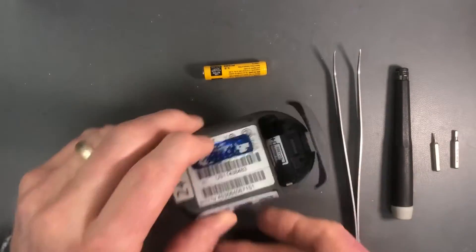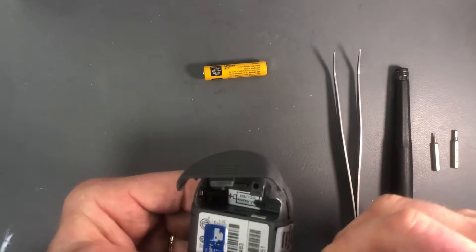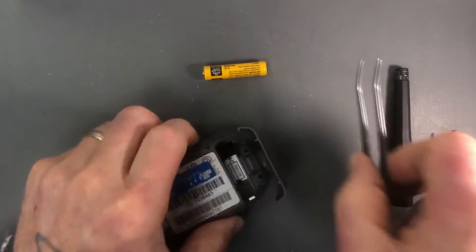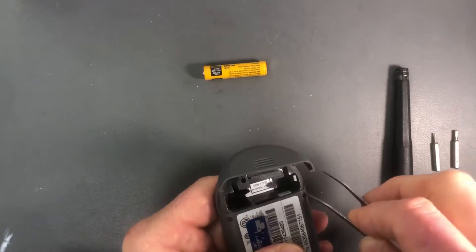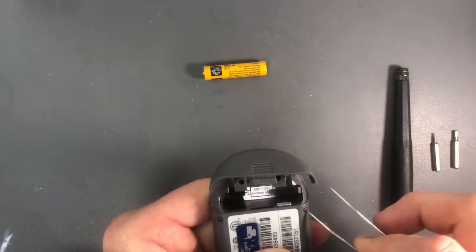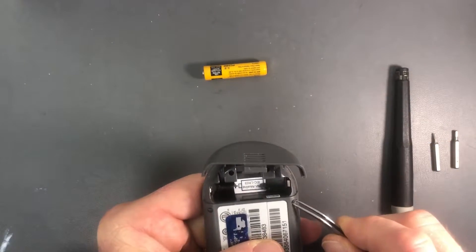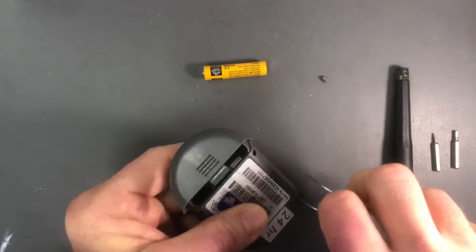In my case I have a sticker that's in the way, so I'm going to go ahead and peel this sticker off. We'll start by removing the little rubber grommets. Just take one side of the tweezers, stick it down along the edge, and pry up until you can get a grip on it. Pull that out, set it aside, and do the same thing for the other four.